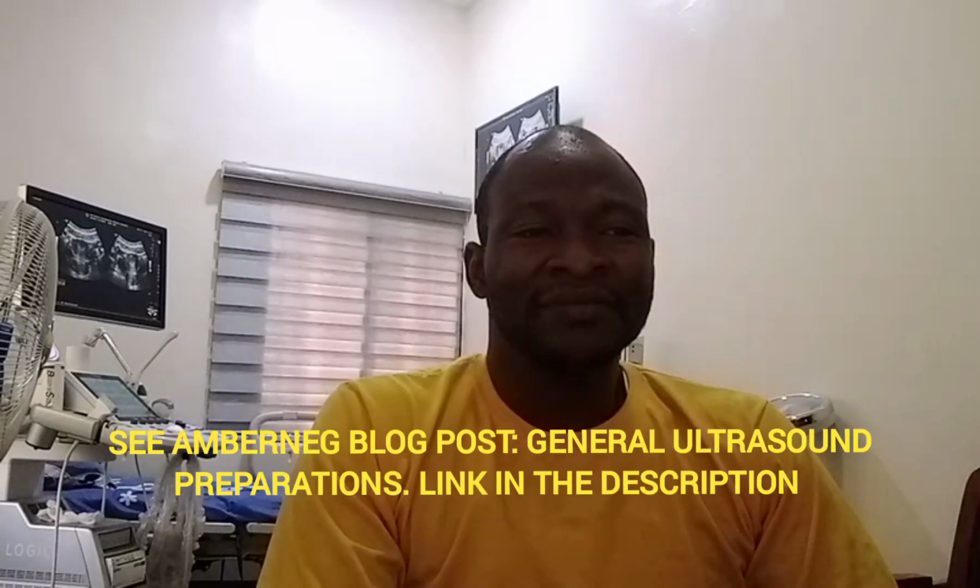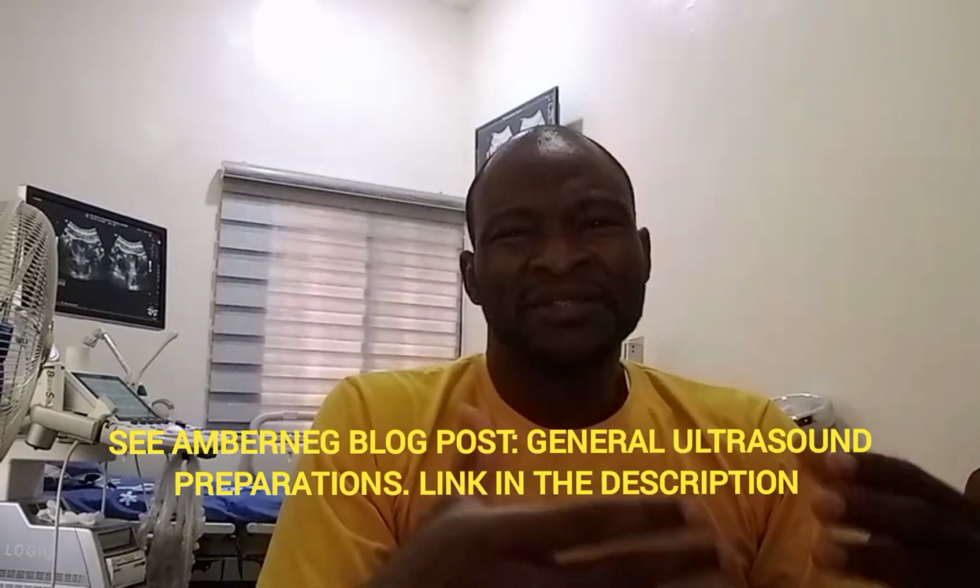Let's take a look at transabdominal sonography. How do we prepare our patients, and what position should our patient occupy during this technique? A reasonably filled bladder is required for transabdominal sonography. Patients are instructed to arrive with a full bladder by drinking a certain volume of water; some measure in cups, some in ounces, depending on your unit of measurement.